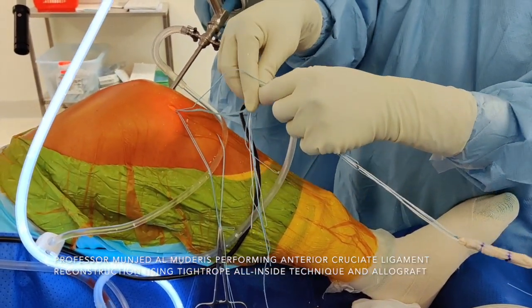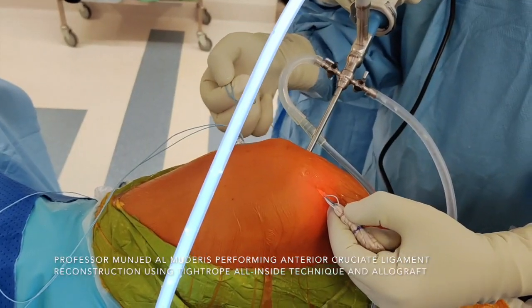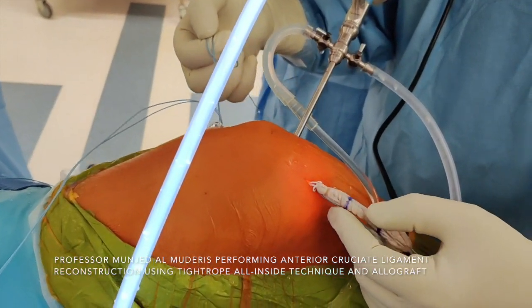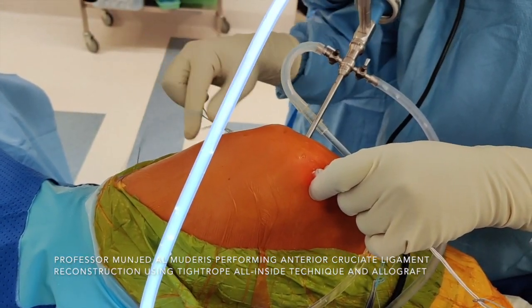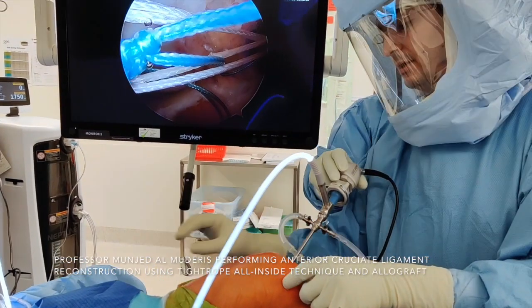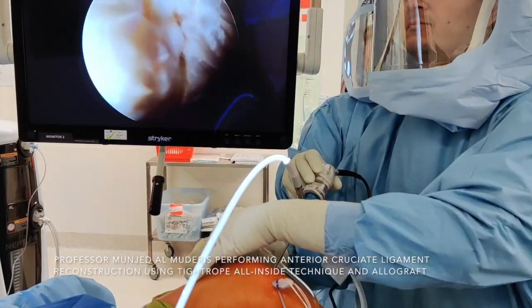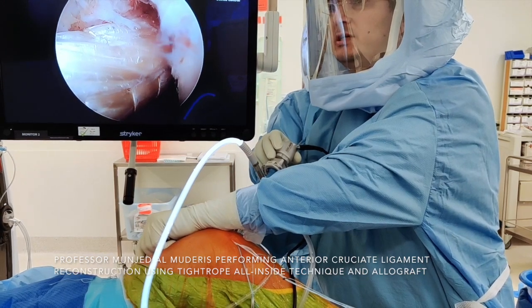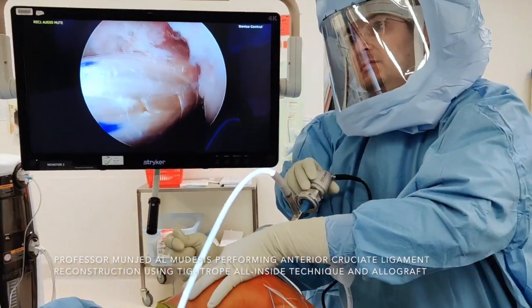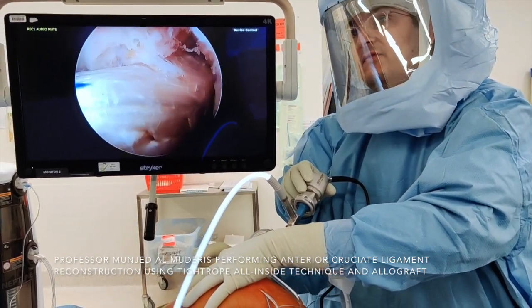The markers show where the graft should sit in the femoral tunnel and the tibial tunnel. This side will be the femoral side. So we pull all the sutures together — this is the core suture of the inner part of the graft, which I tend to pull initially. The blue suture will take the button in, and you can see the graft is coming through the joint. This process needs to be done gently and gradually. Now the graft is seated, and I tension the position of the graft in the socket at the femoral side.